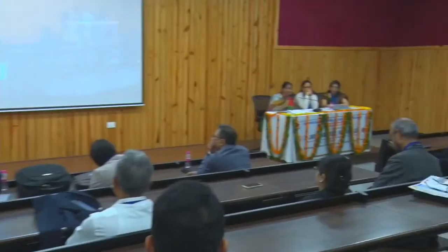Yes, I also second that additional sections are a must. I also second Dr. Prasenjit, but there is a very important point. It is the moral duty of the pathologist to differentiate between reactive atypia and dysplasia. There are certain markers also like P53, P16. So in case you find any atypia or dysplasia, it is mandatory to give additional sections.